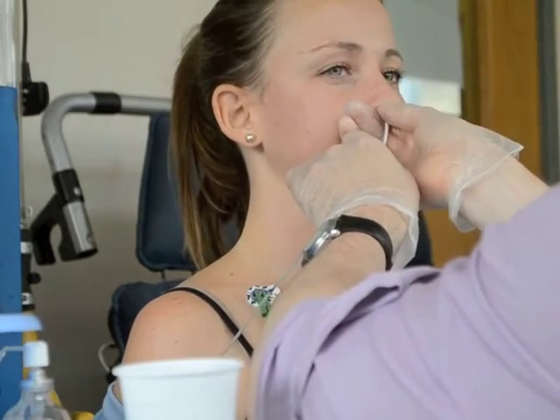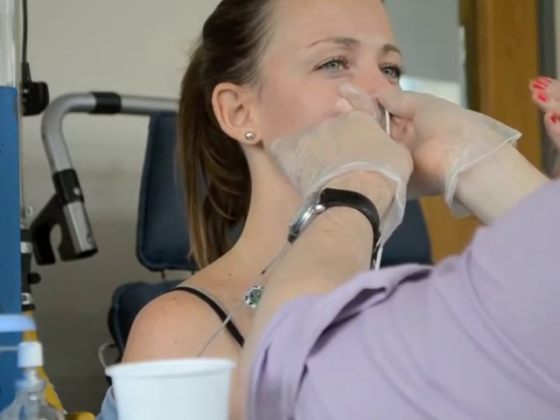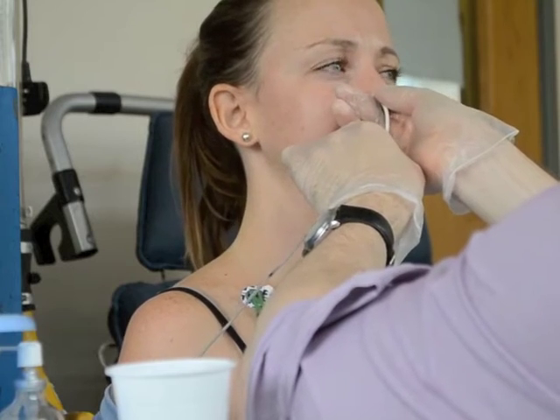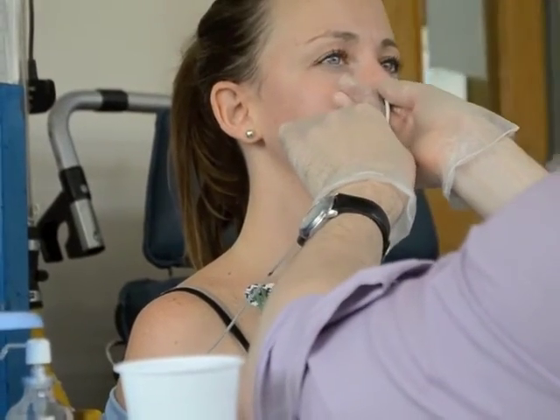There are going to be two tubes going up Monique's nose. The white one measures the electrical activity of the diaphragm muscle, which allows us to see how much traffic the brain is sending down to the muscle and essentially how hard it's working. Whereas the silver/grey one has two pressure sensors on it, which measures the pressure in the lower oesophagus above the diaphragm and in the stomach.